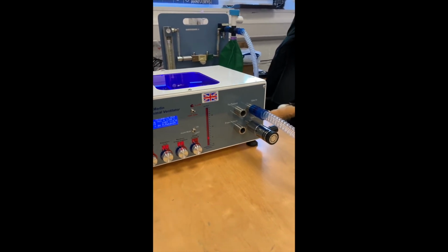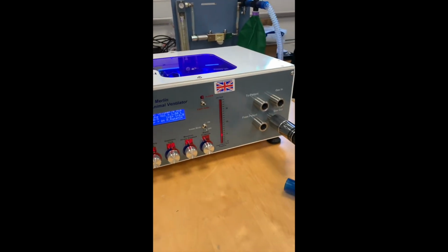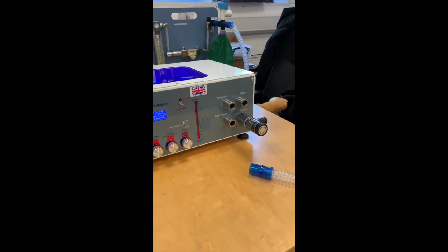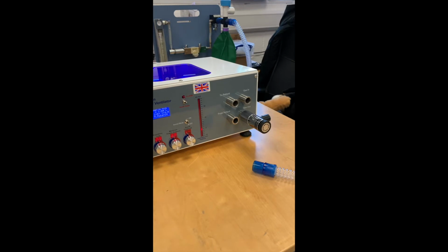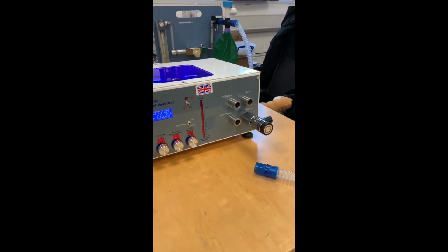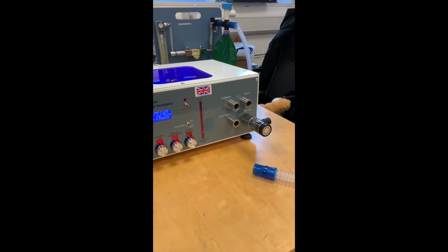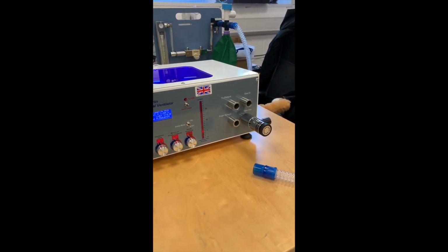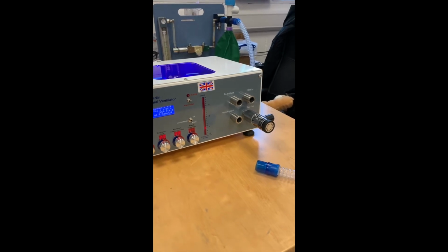Equally, Merlin will be very happy to just pull in room air. So if you remove the gas from the gas in port, it'll pull in room air. If we put a bacterial filter on there, we can ventilate patients on 21% oxygen. If we put a blender, we can feed in air and oxygen and receive blended values between 21% and 100%.